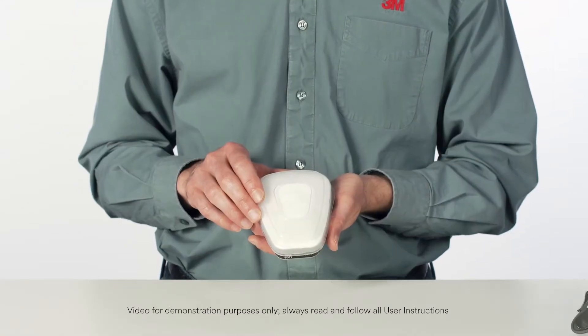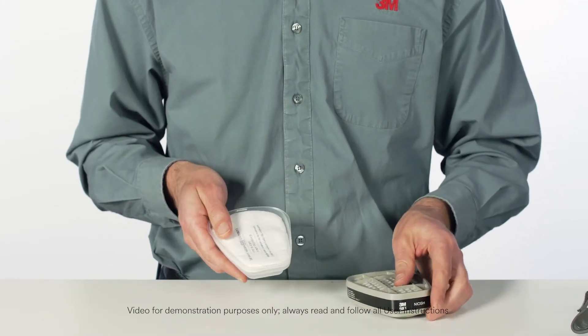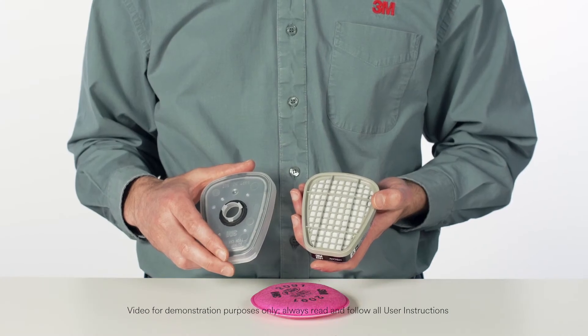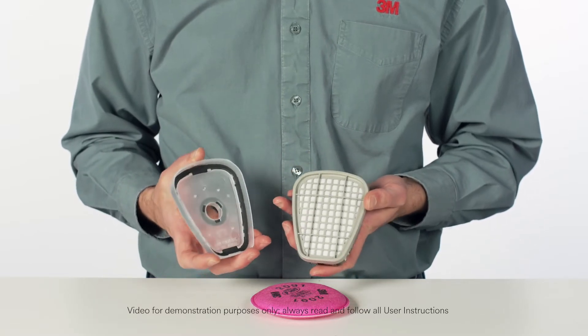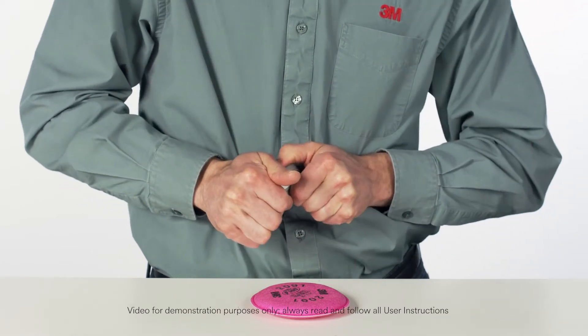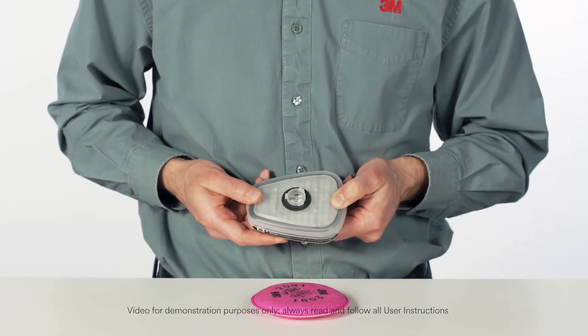To replace the filter, remove the retainer by lifting on the tab. To use 3M Particulate Filters 2000 Series and 2200 Series on top of gas vapor cartridges, the 3M Filter Adapter 502 is required. Align the adapter over the cartridge and engage the front snap and the back snap by squeezing the adapter and cartridge together. You should hear a click as each snap is engaged. The adapter is designed for one-time use only.